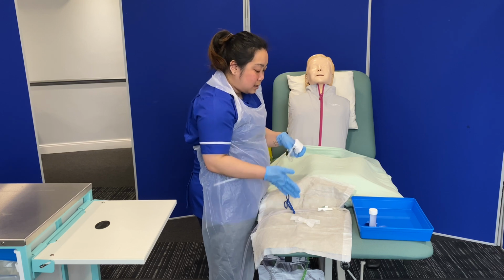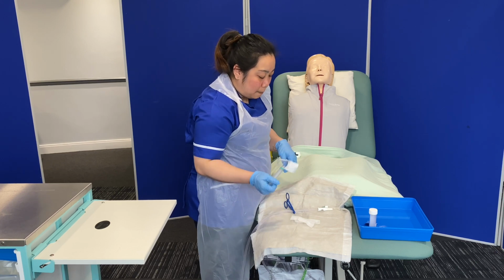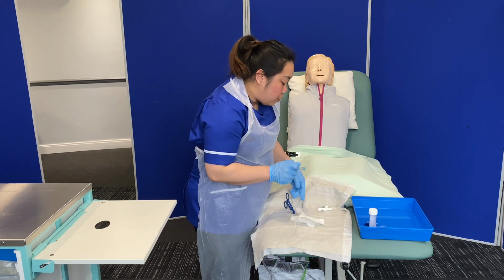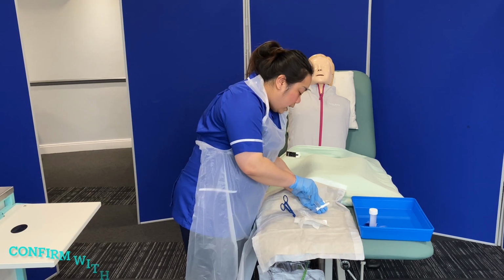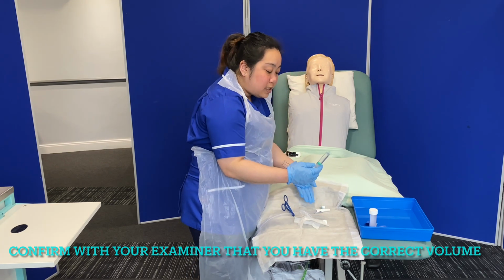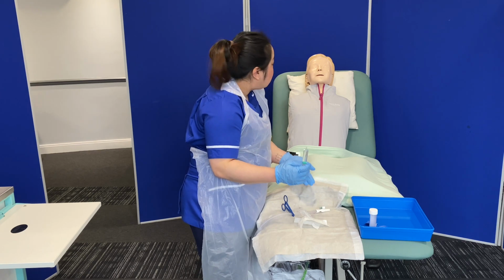And because this is a needleless system, I'm just going to put the syringe directly into the middle of the sampling port, okay? So you shouldn't feel any pain, right? So I have withdrawn an appropriate amount, which is 10 mils. Did you feel any pain at all during the procedure? Not at all. That's good.